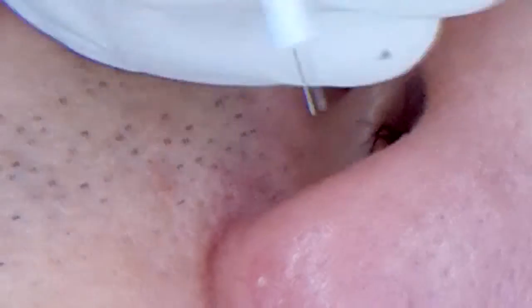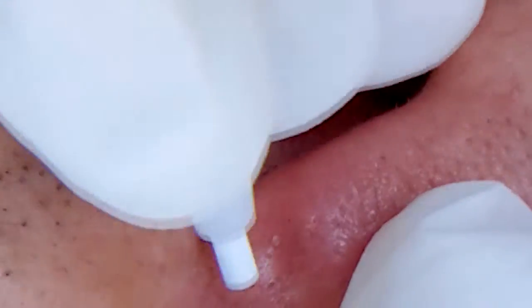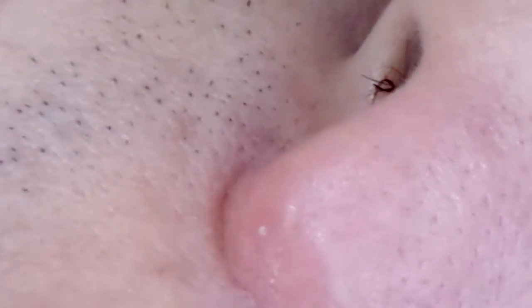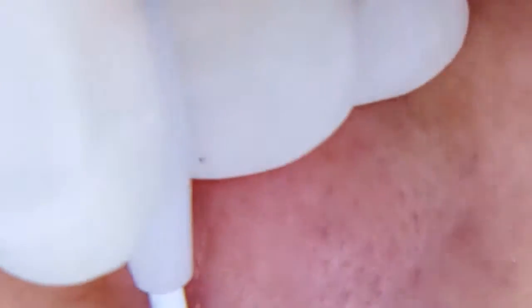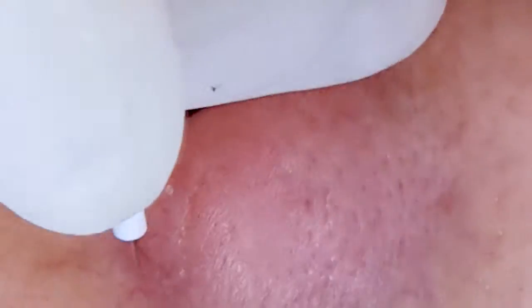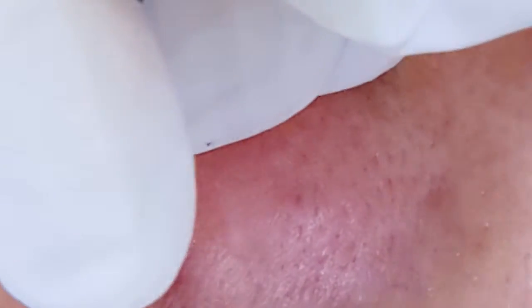Go all the way down. That's okay, it's normal — when somebody's watching, we're always a bit more nervous. Watch your angle. Yes, your pressure is good, but make sure your angle is right.